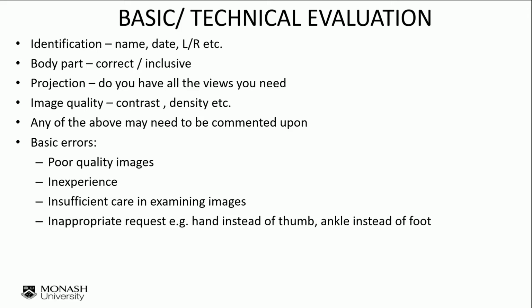And then for the projections, sometimes there need to be additional views. For example, if there's a query radial head fracture in the elbow, then there are additional views that must be done. Or query scaphoid, for example, then again additional views need to be done for that. It's important to look at the image quality, so for example the contrast and the density, and you might have to comment on any of the above points I've mentioned.